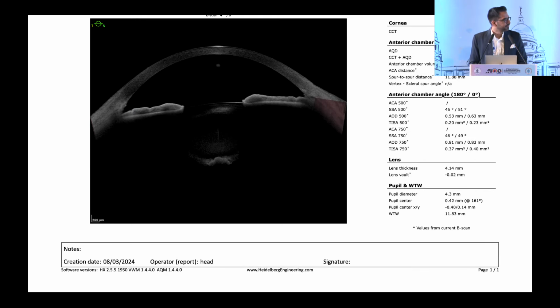So what are the limitations in these patients with fluid vitreous? At times, I feel that this may not hold up, especially in older patients, but this was a relatively young patient with an intact hyaloid face. Whenever you have vitreous syneresis, then this won't work.